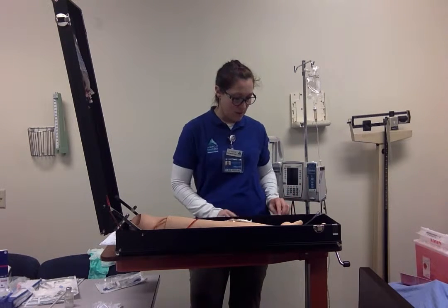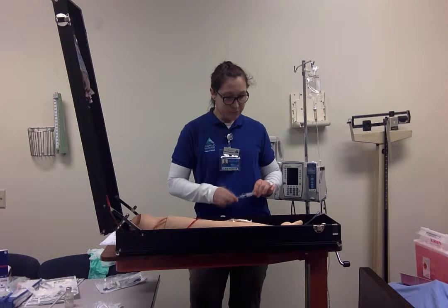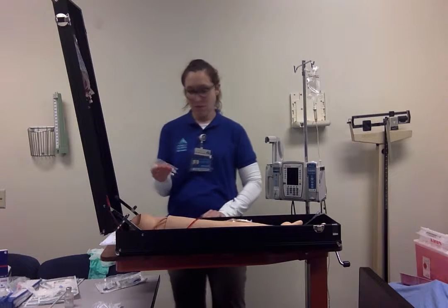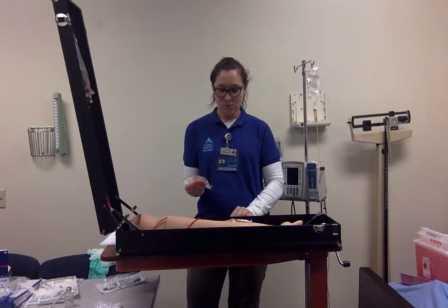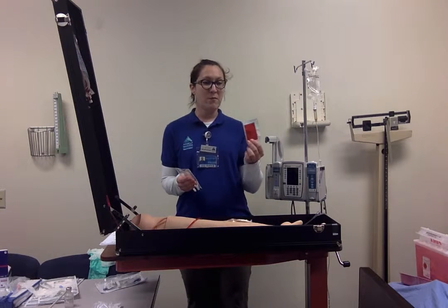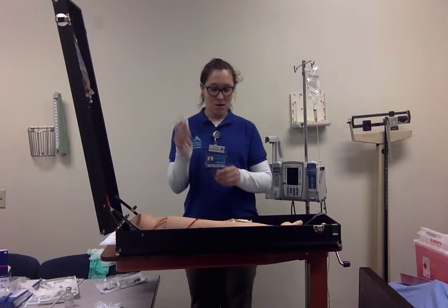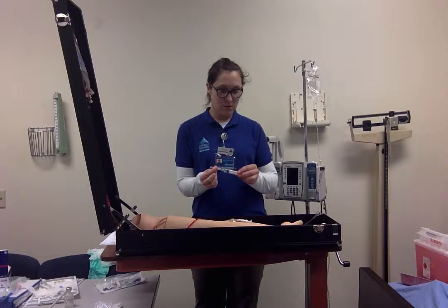Okay, I'm going to set this aside. And next I want to prepare the medication bag, so I'm going to be adding the medication. First I'm going to get the medication labeled, so I'm going to be putting what medication it is, my initials, the date and time that I'm doing it. I'm going to attach it to the bag there so everybody knows what it is. Once that's attached, I'm going to go ahead and add the Rocephin into there.